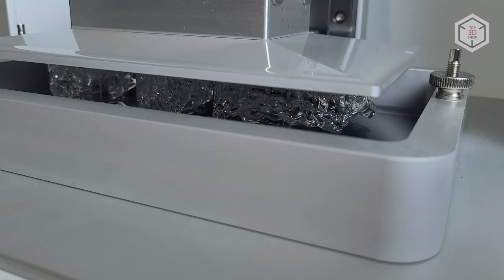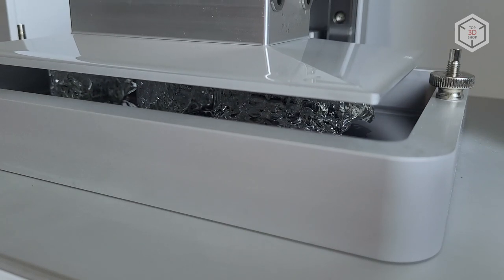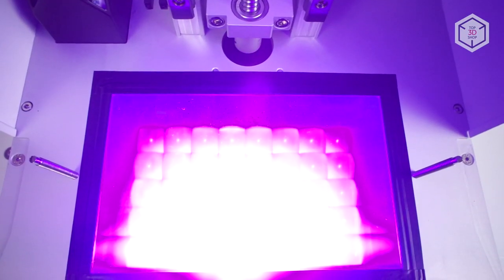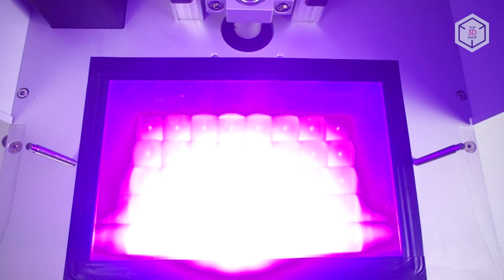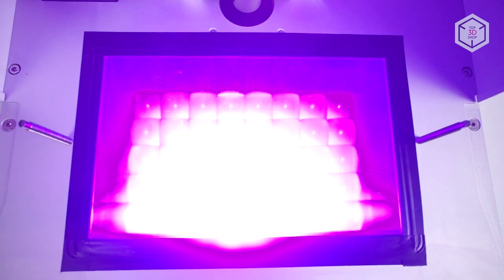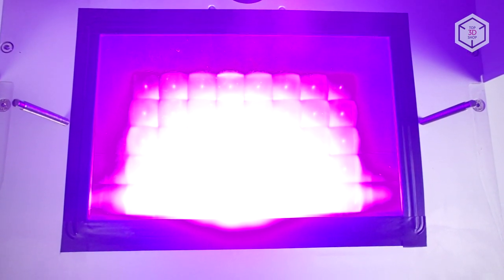Like with most modern MSLA 3D printers, the screen is monochrome, providing good light transmission with less heat emission and geared to work much longer than RGB screens, with Phrozen putting its word to 2,000 hours of service life. The curing light module using Para-LED 3.0 technology is installed under the LCD panel. It comprises a matrix of ultraviolet LEDs with special lenses over them, providing uniform curing over the entire print area.